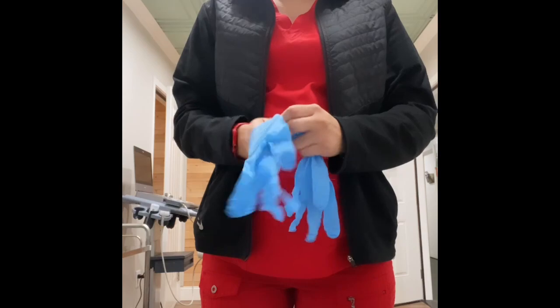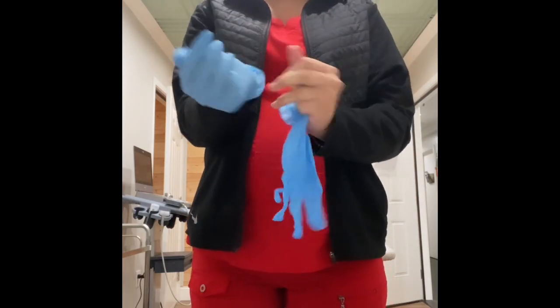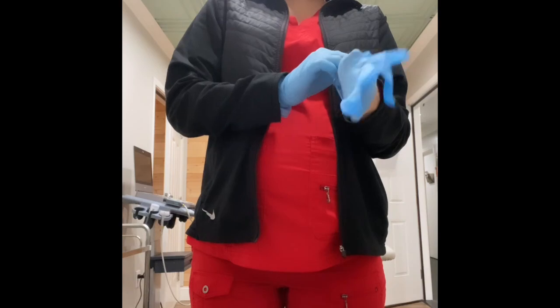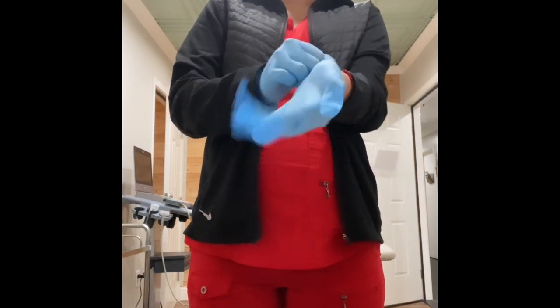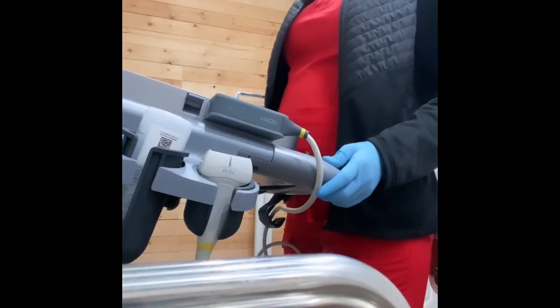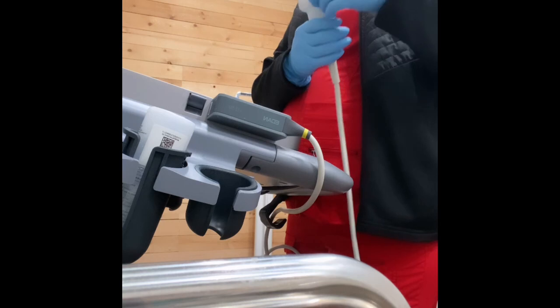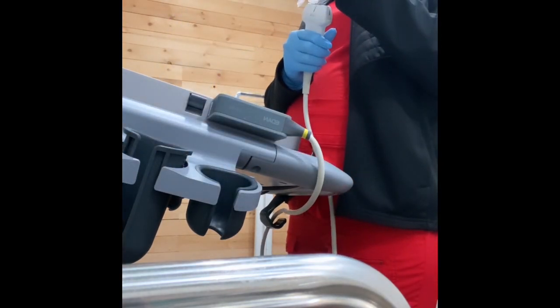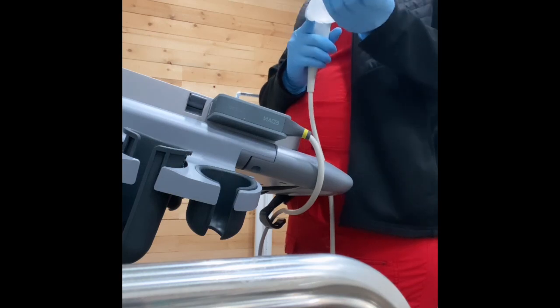Hi, my name is Jacelle and today we will be going over a thyroid protocol. We first start by setting ourselves up by sanitizing and putting our gloves on, then having our area ready. We then set our transducer with ultrasound gel and proceed to put the right settings on the machine.